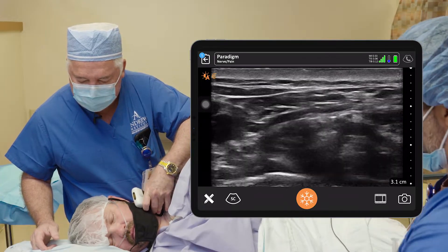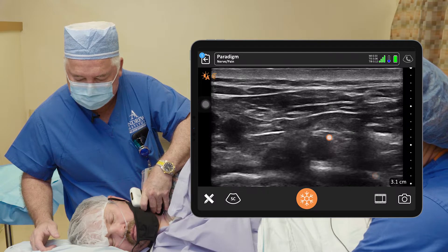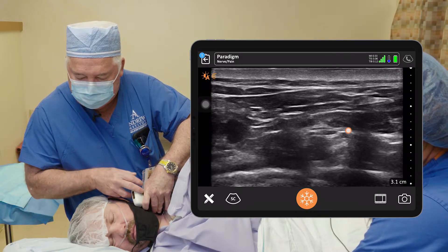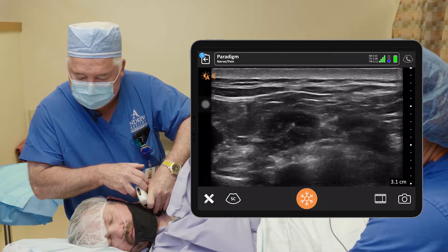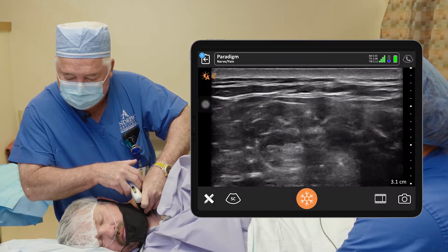We'll go down supraclavicular. You can see the artery with the rib right under it. The brachial plexus right there about 12 to 3 o'clock, and then we're going to follow that plexus back up the neck until we get our stoplight right here between the two muscles.